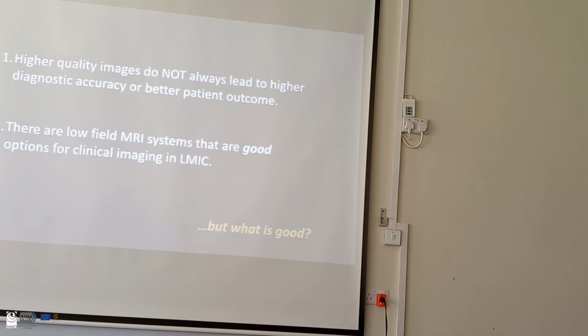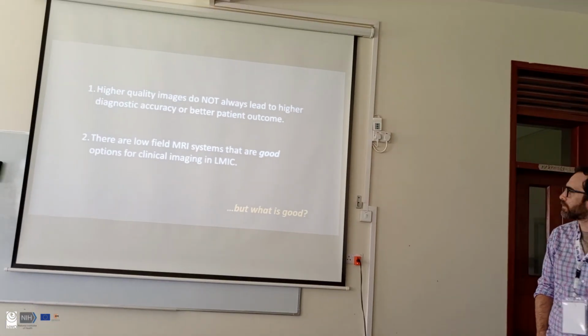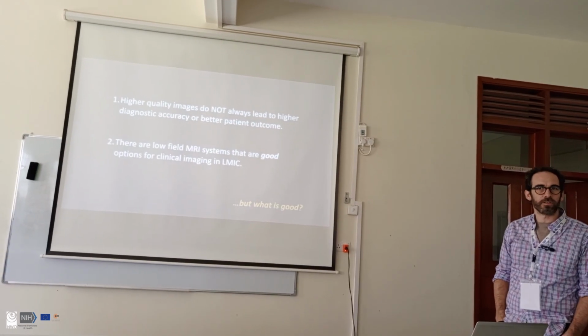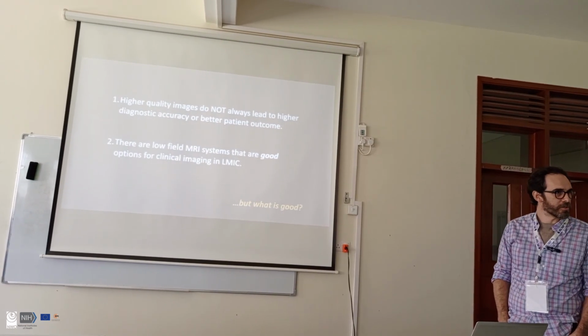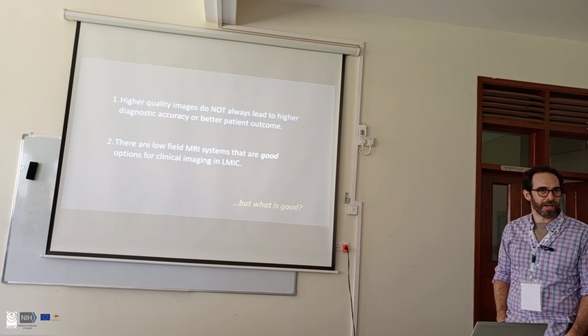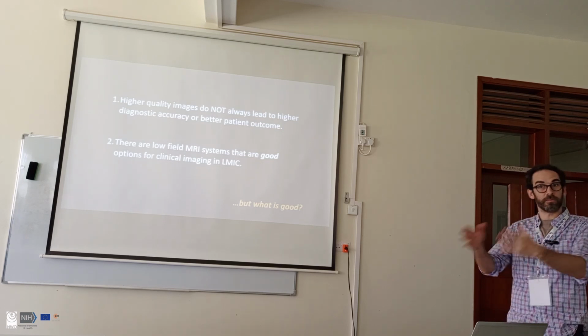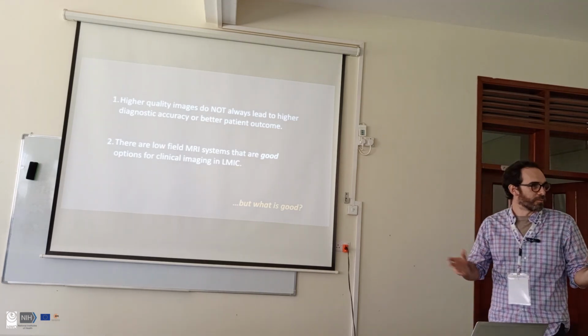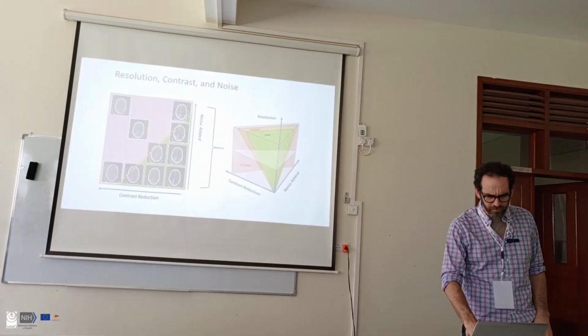So all we know right now is that higher quality images do not always lead to higher diagnostic accuracy. It depends on what you're looking for, right? And there are low field systems that are good options for clinical imaging in low and middle income countries because they have a lot of aspects that are required to actually put them in a clinic, right? But the question still remains, what is good? What is good enough, I guess?